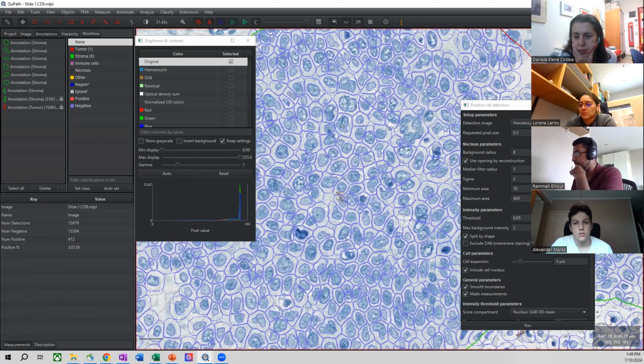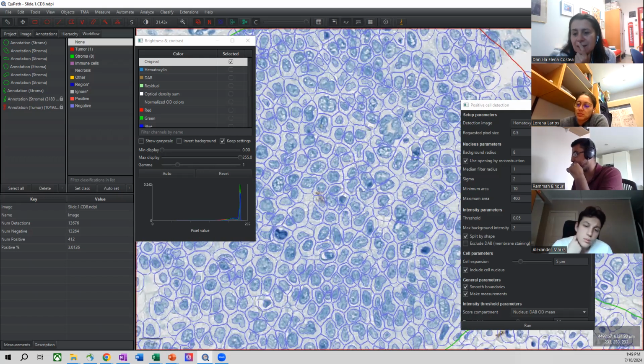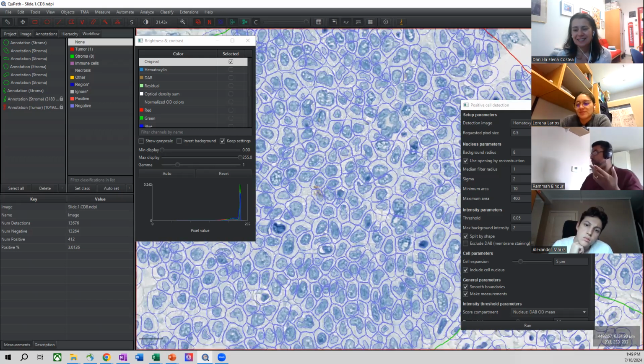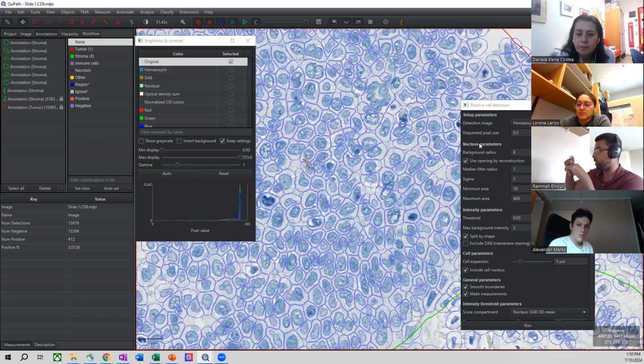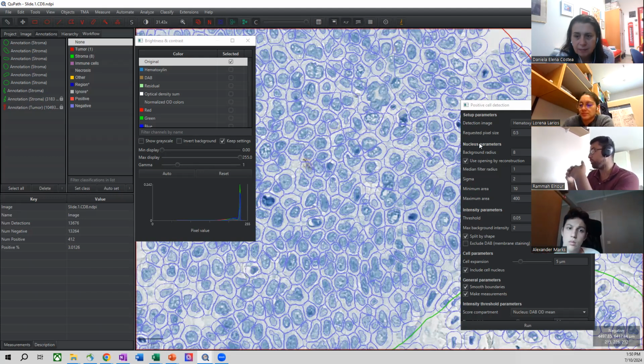From my experience, we didn't have to play too much. Maybe. No, I did. In my experience, I played around with it too much and realized that I shouldn't have done it to begin with. You know what I mean? For me, it's more about learning what everything does. But when you look at your TMAs, if you notice that something is very wrong, then you can start making small adjustments to one parameter at a time, as opposed to making a whole bunch of adjustments, because that just becomes chaotic.